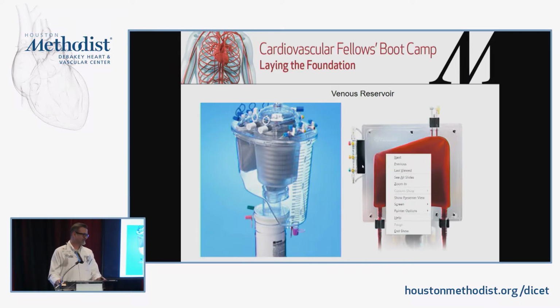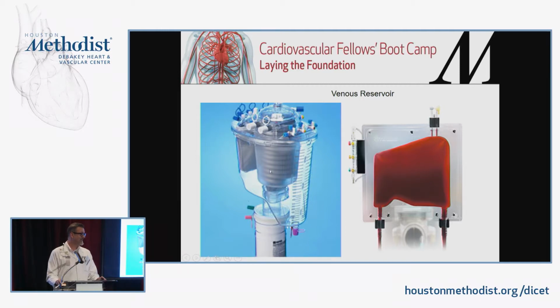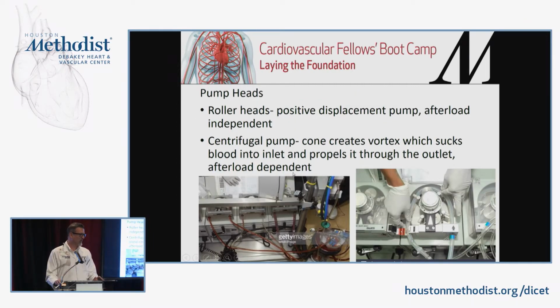Venous reservoirs. So really, the venous reservoir, the one I use looks like this. There are some like these I haven't really seen. And the interesting thing about this is that you always have to have a certain amount, and they like 200 or 300 in there, and your perfusionist will tell you. They'll be like, I need more volume. So you'll put the pump sucker over in the chest and try to pull some volume off. If it goes below a certain level, and they have alarms and everything, it'll suck air, and you don't want that to happen. So they can put volume in there and add volume as needed. They can add blood. We don't usually do that. Or add albumin, or just saline. But you need to keep a certain amount of volume in here. And every perfusionist has their number that they will live with or won't.